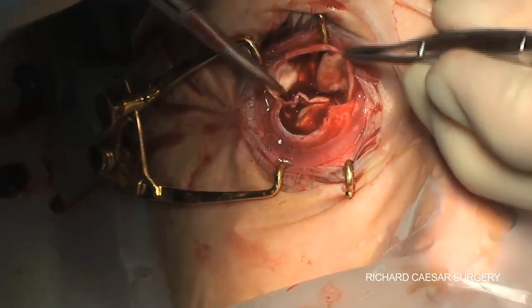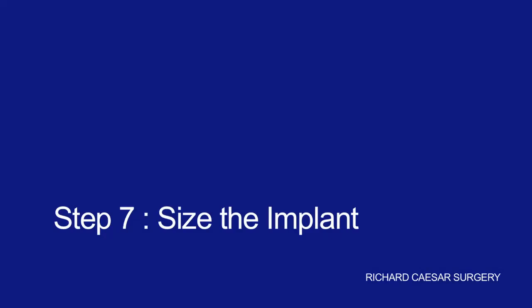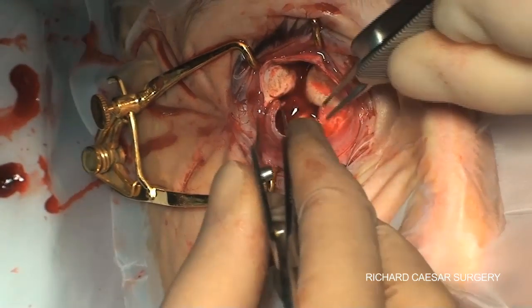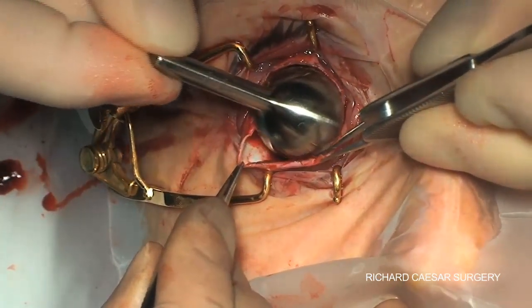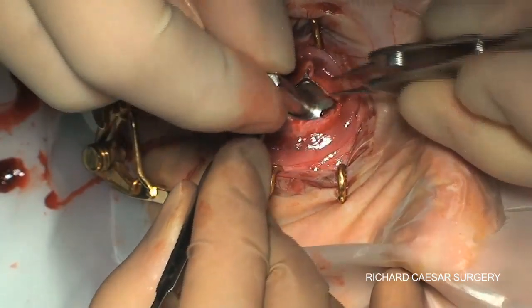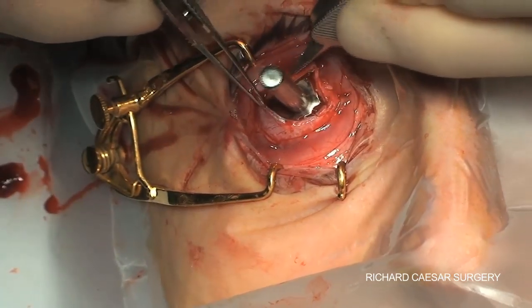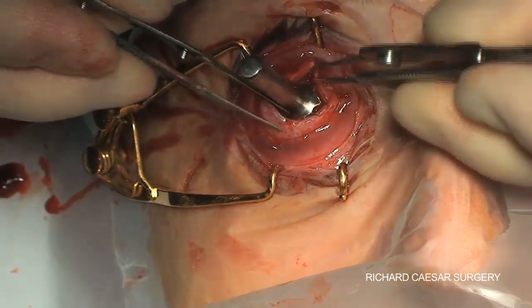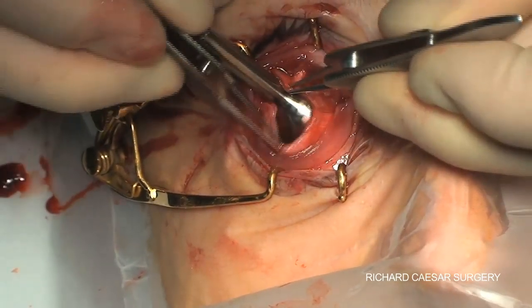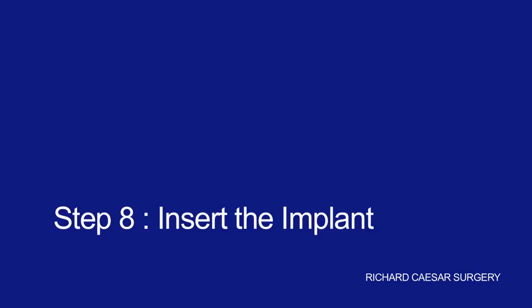Cleaning and inspecting the sclera is very useful and you can remove any residual bits of uveal tissue. The sizers are fantastic in order for you to determine what size implant you can put in easily — they slide in effortlessly. You can tuck your edges around them and they also have the benefit of having a compressive weight, which means that while they're in they also help stop any residual oozing. This confirms that I can put a size 20 implant in and close it easily.